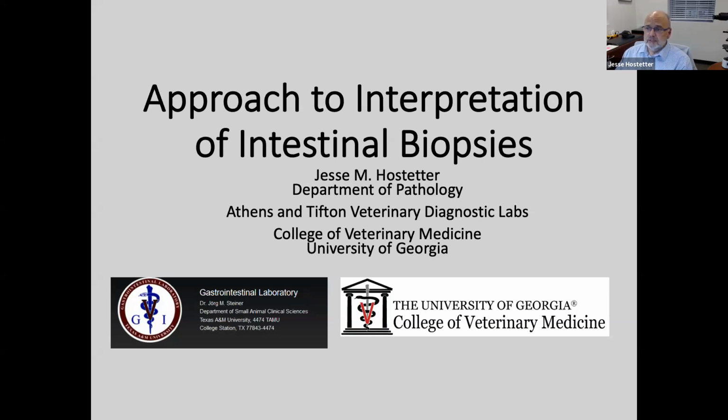Since 2011, I have done some work for the Gastrointestinal Laboratory at Texas A&M University, and I read GI biopsies along with several other pathologists remotely. They're located in Texas, and I read those from Georgia. Over the years, I have seen a few endoscopic and full thickness biopsies. I've learned a few tricks and some strategies, and it's those kinds of things that I really want to share with you tonight, to give a practical approach to looking at biopsies of the intestinal tract.